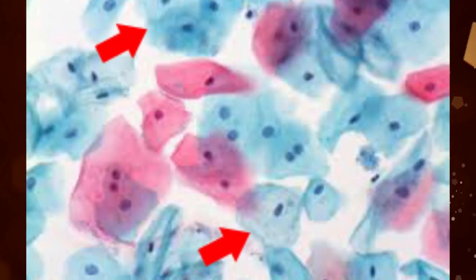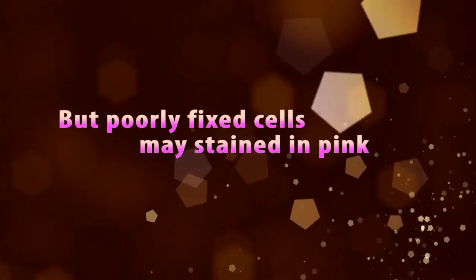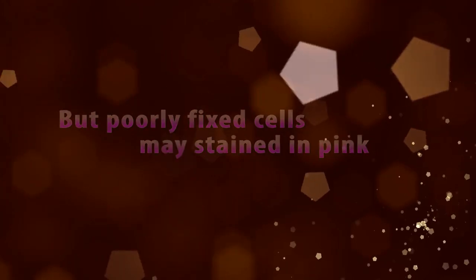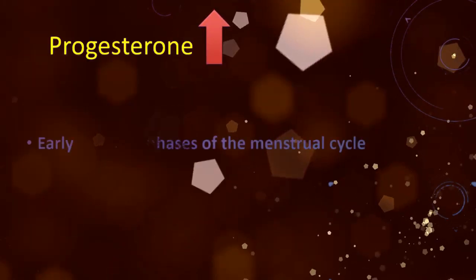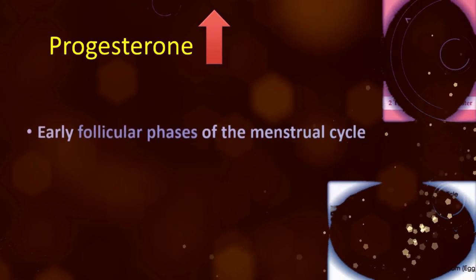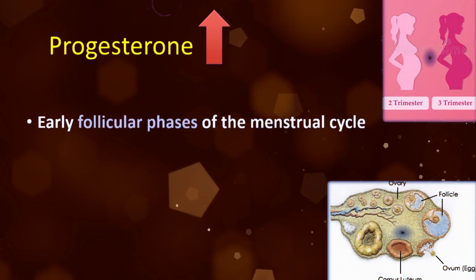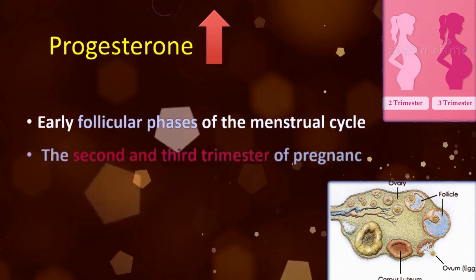The cytoplasm is abundant and translucent, getting a green color, but poorly fixed cells may stain pink. Intermediate squamous cells are seen in abundance when progesterone is at high levels. This occurs during the luteal and early follicular phases of the menstrual cycle, and the second and third trimesters of pregnancy.